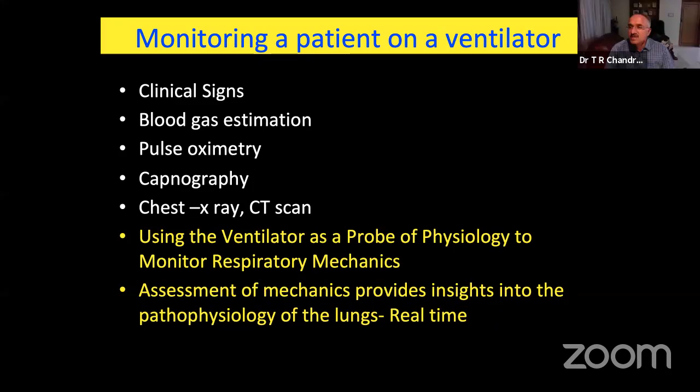Yeah. Using the ventilator as a probe of physiology to monitor the respiratory mechanics. The tube you put sends in the air. It's like if you compare it to an ultrasound machine, there you give ultrasonic waves. Here you are giving air, and there are airways and tissue, or the alveoli, and it reacts with them. And the information the ventilator gets back is what is displayed as scalars and loops.